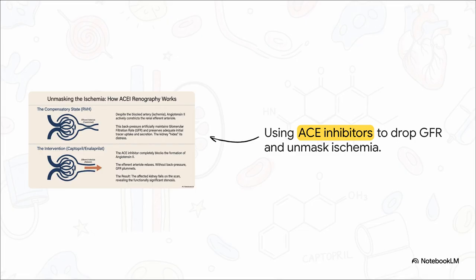Well, in this compensatory state, angiotensin II artificially preserves the kidney's GFR by clamping down on the efferent arteriole, the exit pipe. It's basically hiding its distress. But during this scan, we administer an ACE inhibitor like Captopril to act as our truth serum. By blocking that angiotensin II, we pull away that compensatory back pressure. The efferent arteriole relaxes, and the GFR of the diseased kidney just completely plummets. We literally force it to fail on camera.